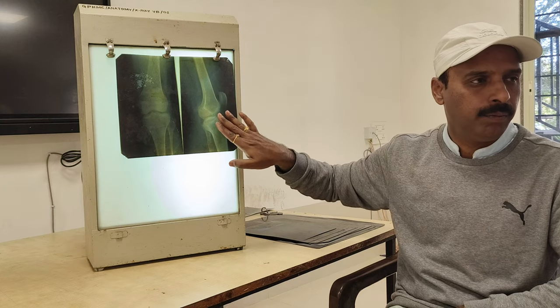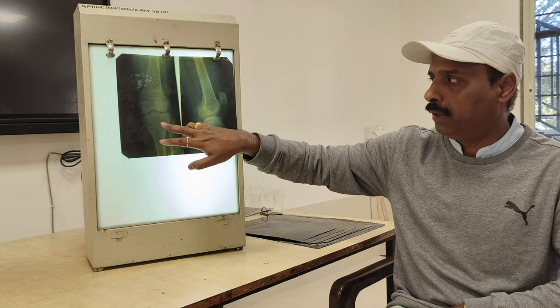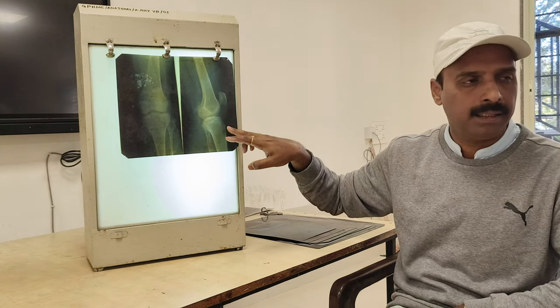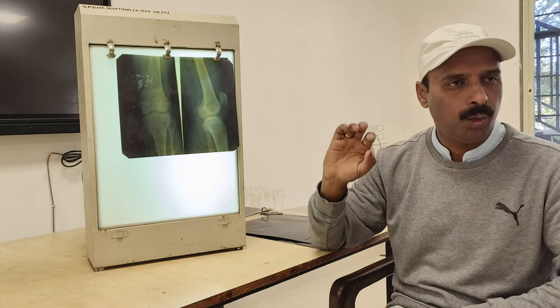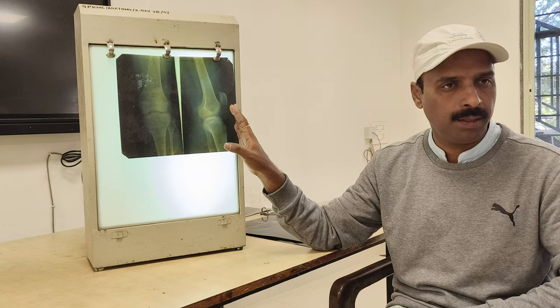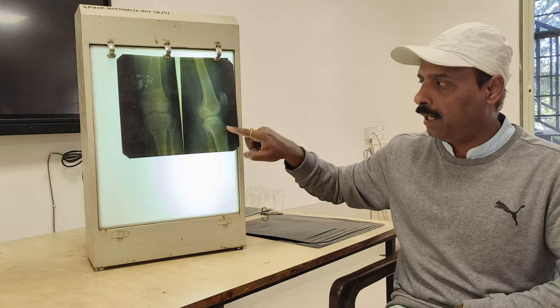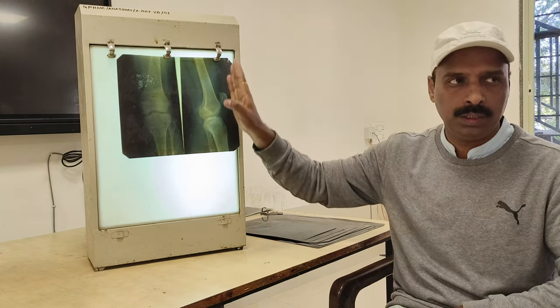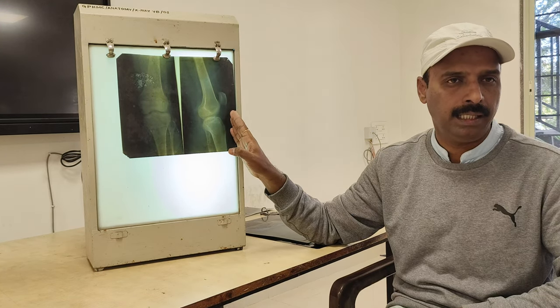And this is a lateral view of the knee joint, and we are going to get the AP view of the knee joint. So AP, and this is a lateral view; you can see the x-ray in this. You have to comment on this x-ray: this is a plain x-ray of the knee joint showing the lower end of the femur, patella, upper end of the tibia and fibula, and it shows the two side by side, one is the AP view, and the other is the lateral view.